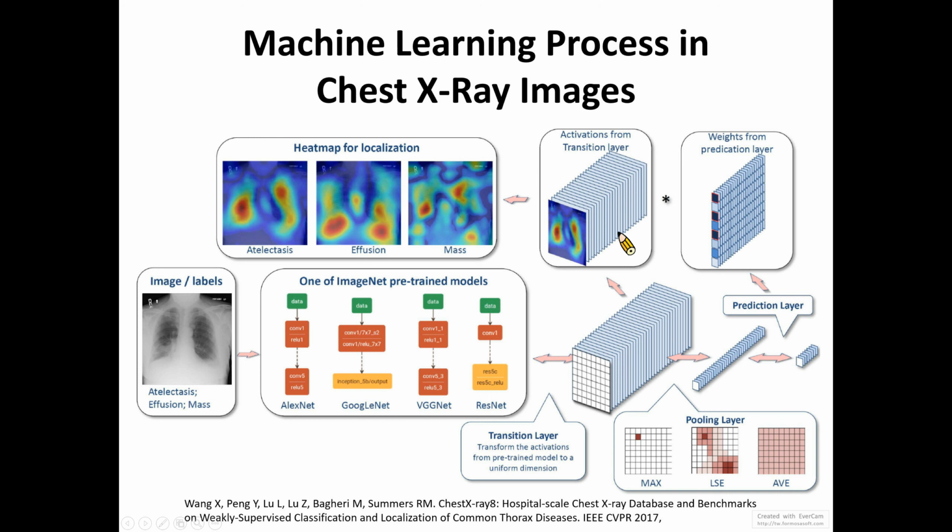And this is one of the applications proposed on the internet. It's called MedChecks. It's an e-alert system for automatically detecting pneumonia from chest X-ray images. They use machine learning algorithms, pre-trained models, and have already developed a web-based platform to diagnose pneumonia. And we also developed a cloud-based X-ray image platform in the Digital Medicine Center at the National Yang-Ming University.